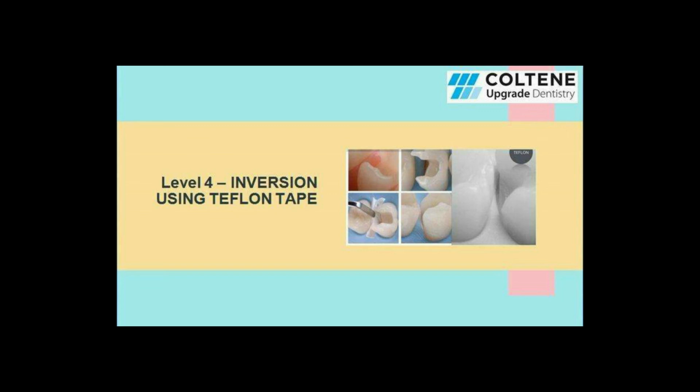The next level is level 4, which uses Teflon tape for inversion. Teflon tape, or the plumber's tape, is very good in this procedure, and it is holding a very good position nowadays in restorative dentistry. So when you're using this Teflon tape, it pushes the rubber dam sheet deep into the gingival crevice and helps in inversion of the rubber dam sheet.